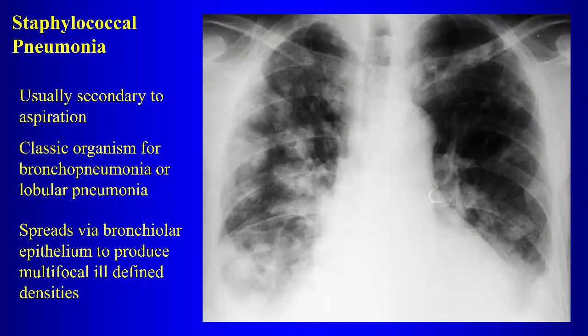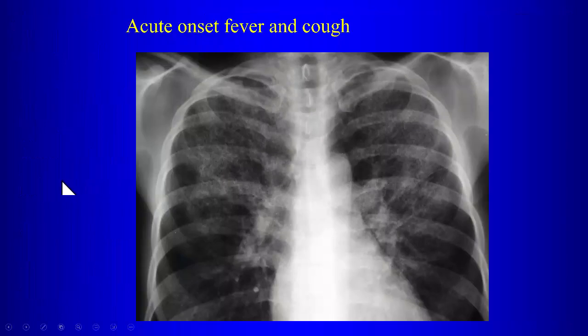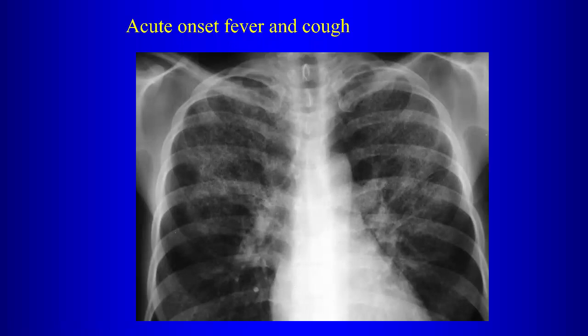Bronchogenic spread via the airways produces multifocal ill-defined consolidation. Now if this patient has fever and cough, what is different about the appearance here? There's ground glass and also a reticular pattern — lines within the lung. This is called atypical pneumonia, used when pneumonia doesn't look like typical airspace disease with consolidations and air bronchograms.